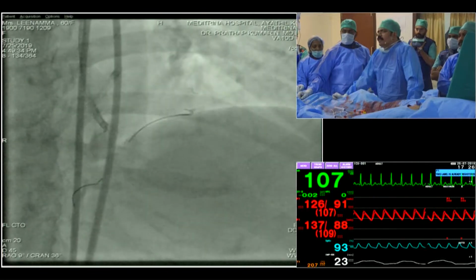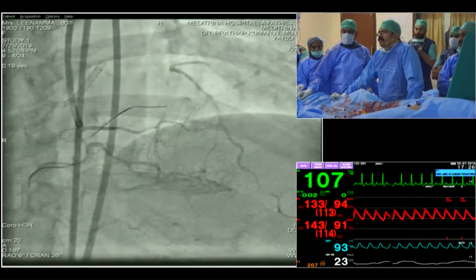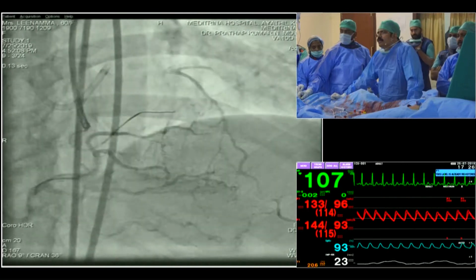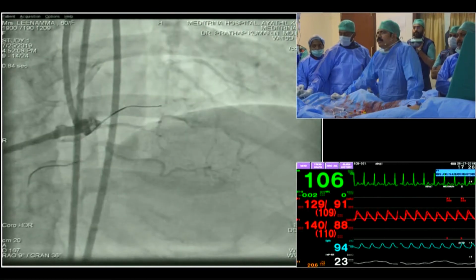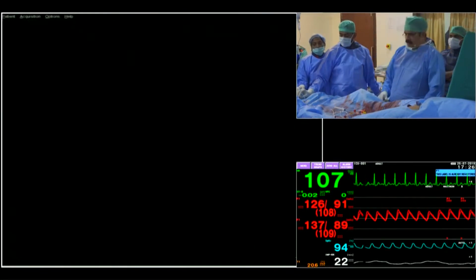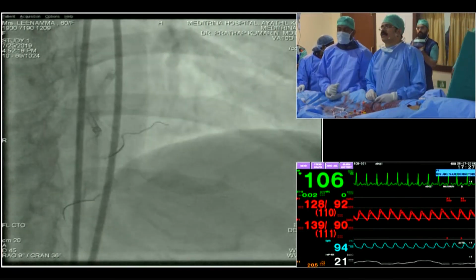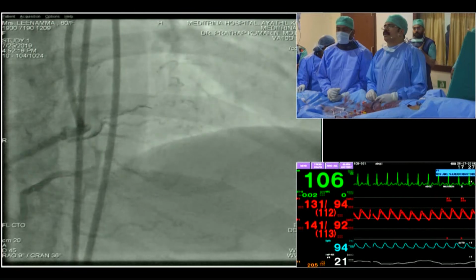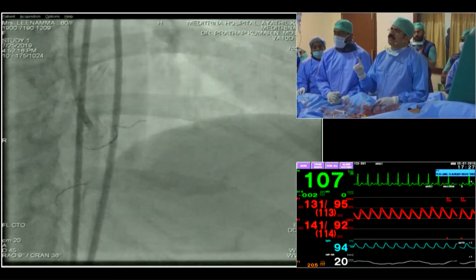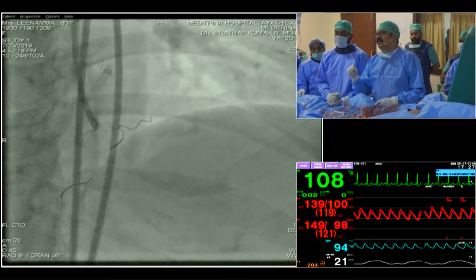I think it's important to point out, though, when you go through those types of collaterals, epicardial or conus, they're much more fragile than the septals, and the potential risks are probably a little bit more as well. So in an experienced operator like yourself, Hans, I think it's reasonable to try, but for people that don't do a lot of CTOs, these are things that I would be very careful with. Generally, septal collaterals are preferred over epicardial. Yes, Sushil, it's actually perfect, because since the septal collateral I did not get, I took the epicardial.